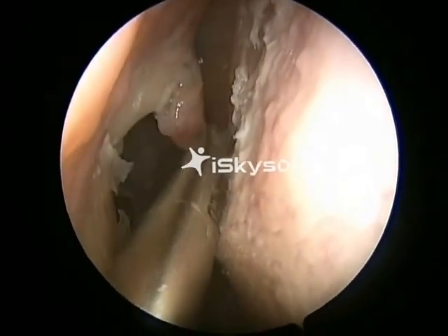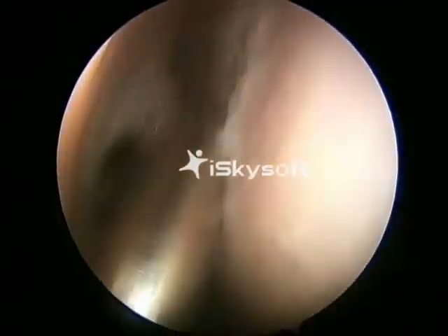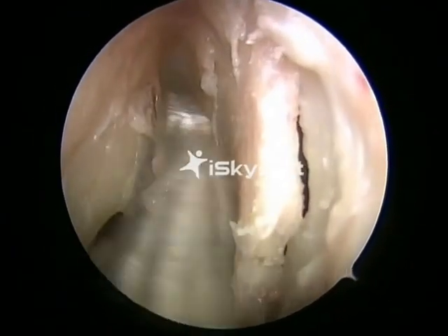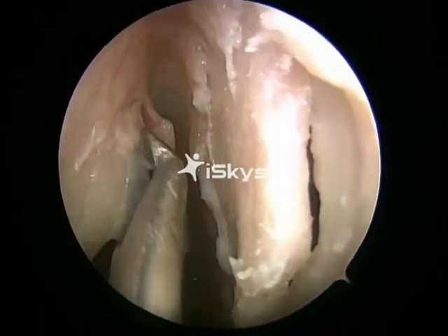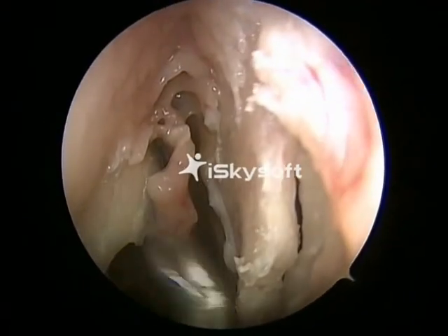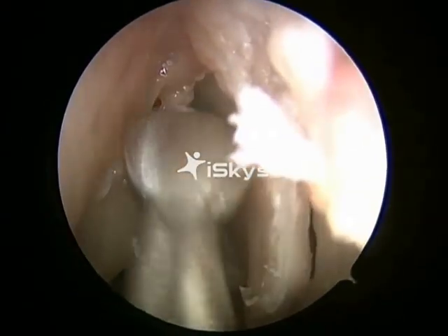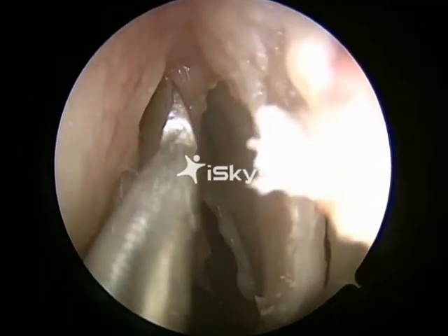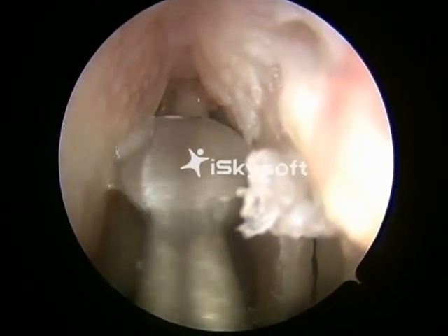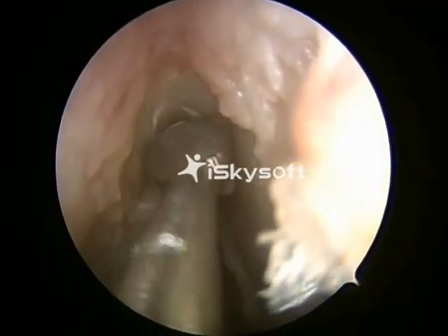Once this is done, the next step would be the identification of the first olfactory neuron. And for that, mucosa over the middle turbinate and the septum in the region of the olfactory cleft should be elevated and pushed gently posteriorly so that the first olfactory neuron is exposed. It is very important to identify the first olfactory neuron because this forms the posterior limit of dissection.